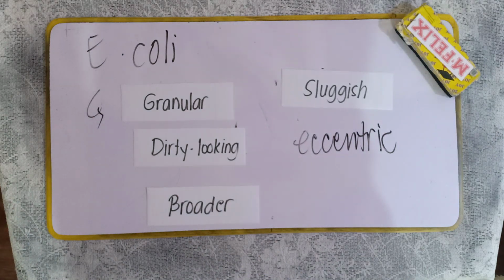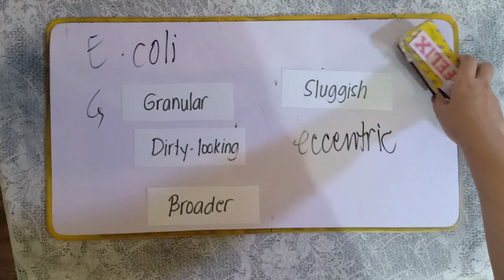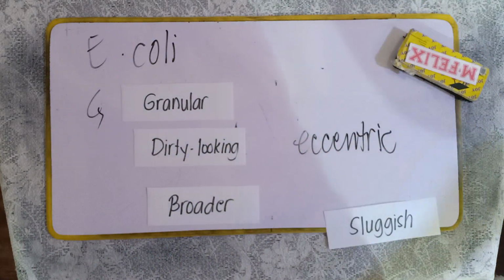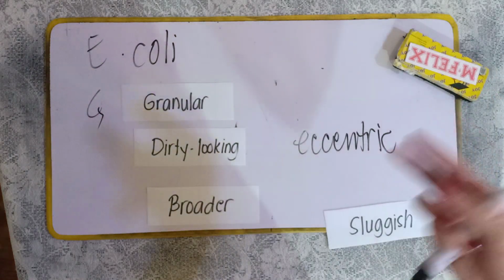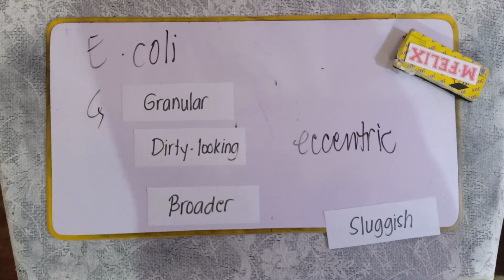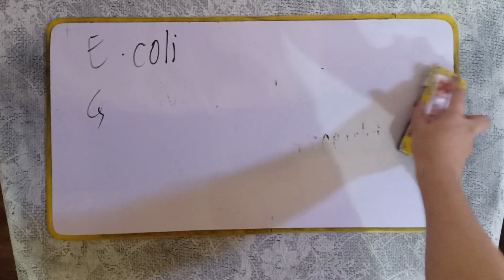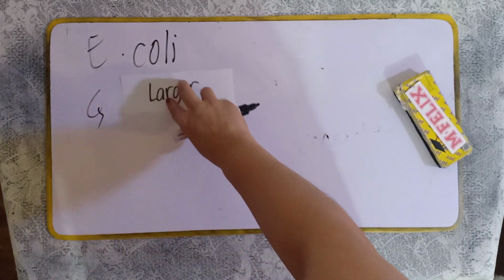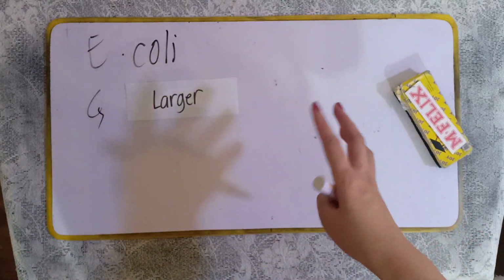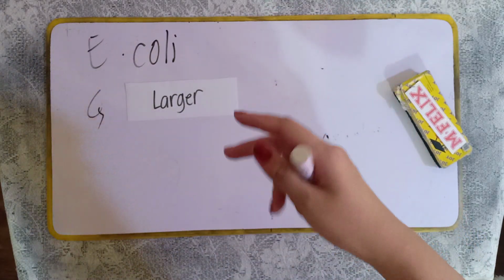And then, when it comes to their cyst naman class, an E. coli cyst may be differentiated from Entamoeba histolytica on the basis of these differences. Yung cyst ng Entamoeba coli natin, it is usually larger. Mas malalaki ang mga yan compared to your E. histolytica.